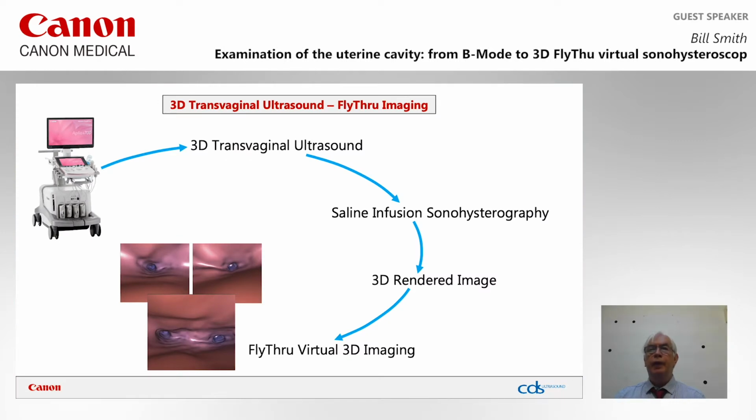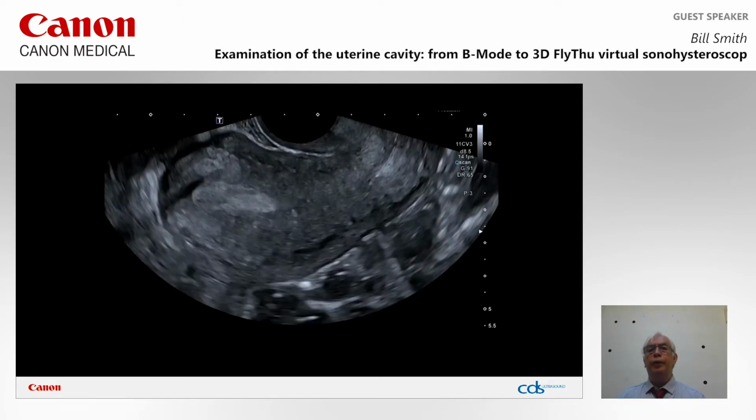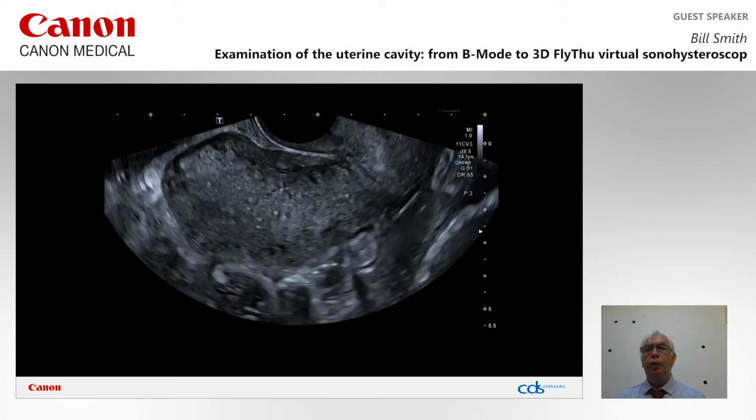It promotes the diagnostic value of Saline Infusion Sonohysterography, or SIS, and it introduces you to the concept of fly-through virtual 3D imaging. We'll start off with this parasagittal section through the uterus.